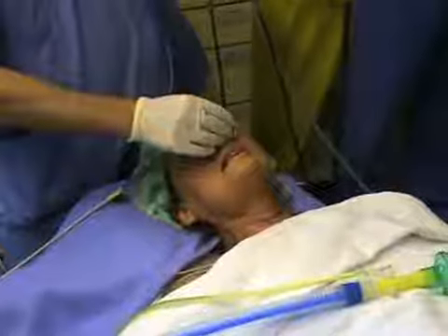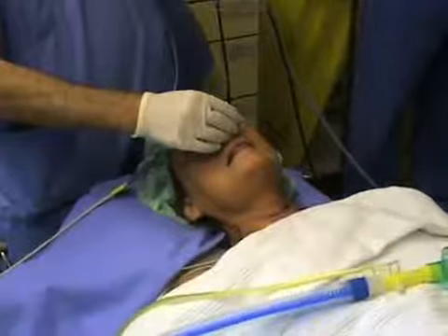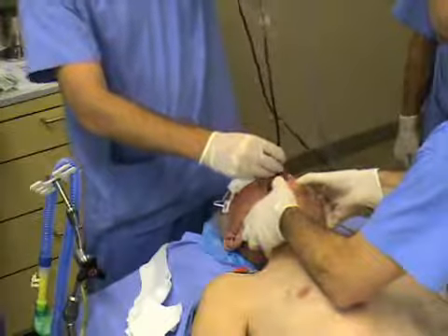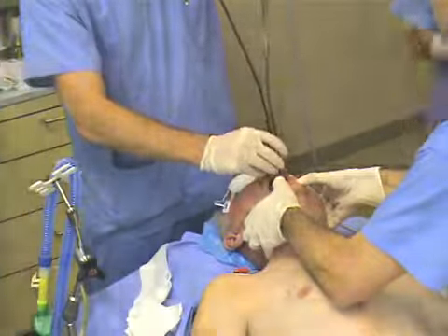This video will demonstrate a nasal approach in an awake patient with a difficult airway and will also demonstrate an oral technique in an anesthetized patient whose airway presents an unanticipated difficulty.